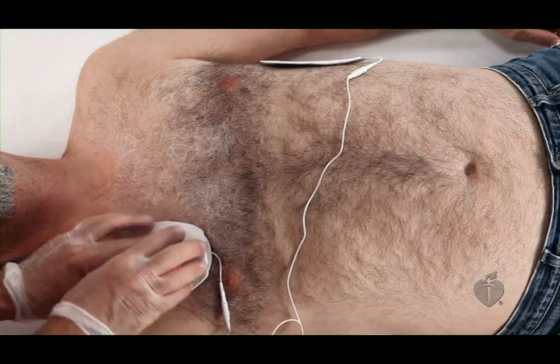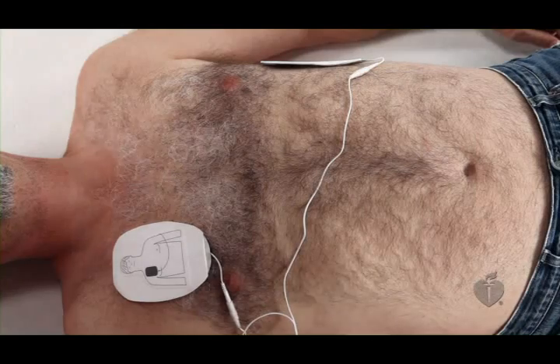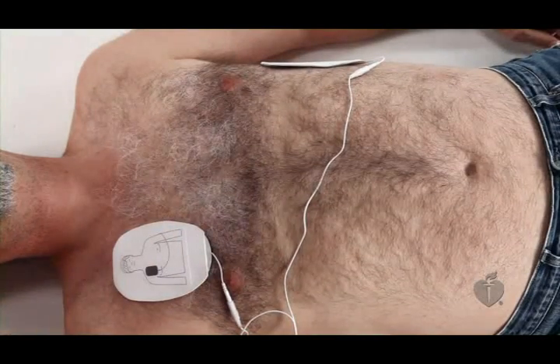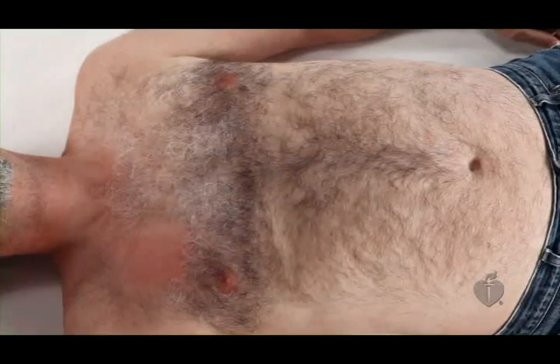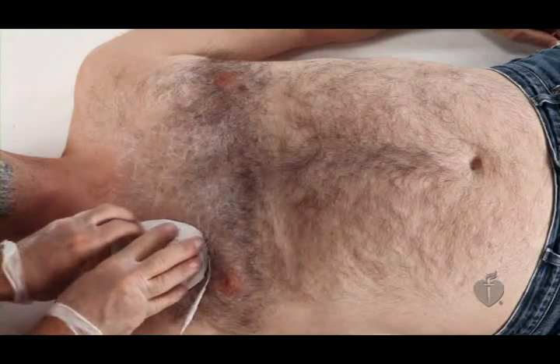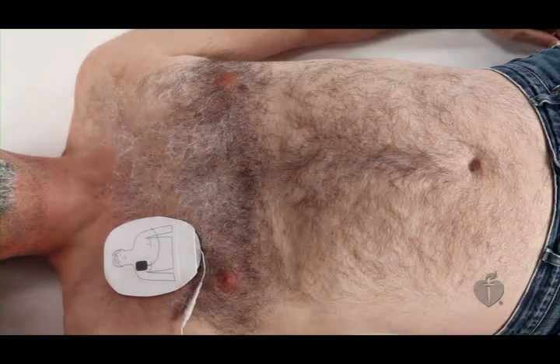If a victim has hair on his chest, the hair may prevent the pads from sticking. The AED may tell you to check the pads. If this happens, press the pads down more firmly. If they still aren't sticking, rip the pads off forcefully, removing the chest hair. Then reapply a new set of pads to the bare skin. If your AED supply kit has a razor, you can use this to shave the area as well and then reapply a new set of pads.